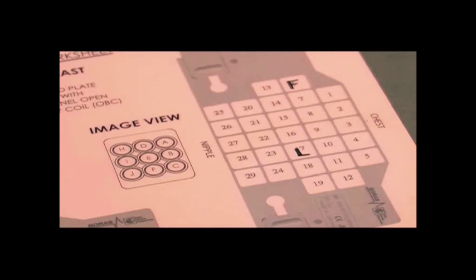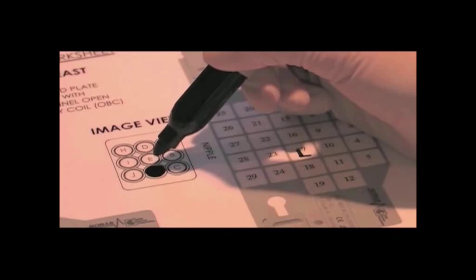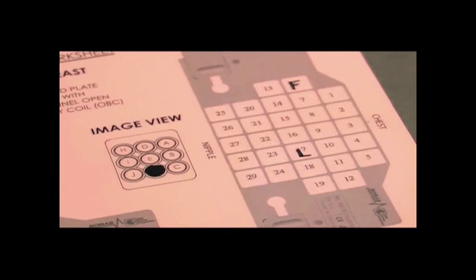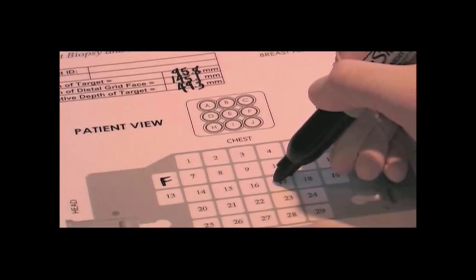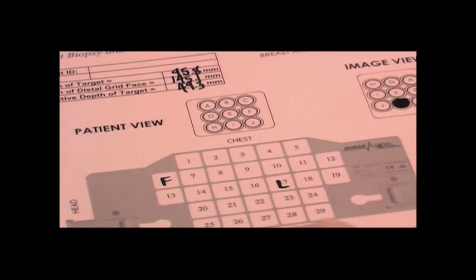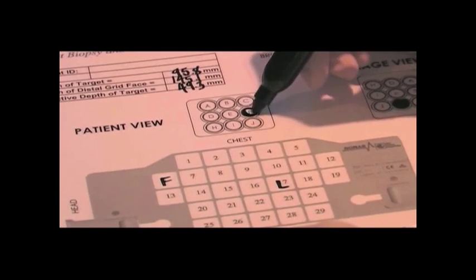On the compression grid image, locate the marking cursor for the lesion. Compare its relationship to the location of the fiducial by counting the grid squares from the fiducial to the lesion. Mark the lesion target in the appropriate grid space on the image view of the grid worksheet. Then, looking at the nine-hole needle guide image located next to the grid graphic, select a lettered hole that corresponds to the location of the lesion. This will identify the point of entry into the breast. After you have calculated this information in the image view of the grid worksheet, transfer the data to the grid and needle guide graphics on the patient view side of the grid worksheet. You now have the x and y coordinates.